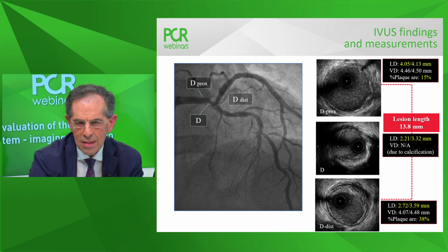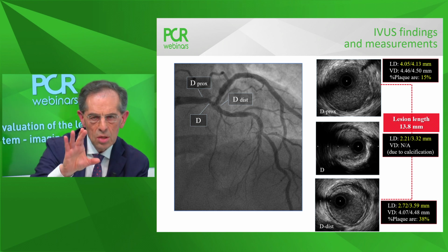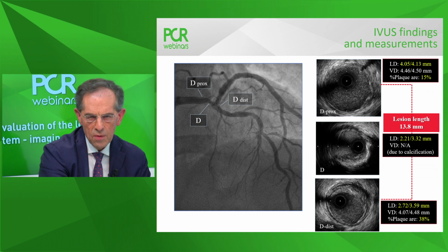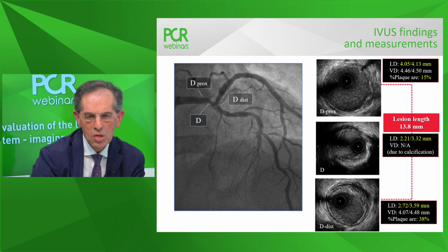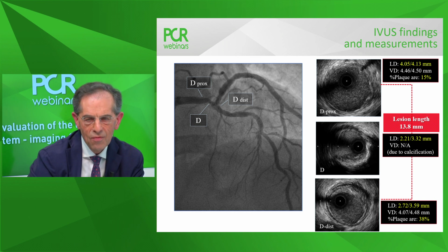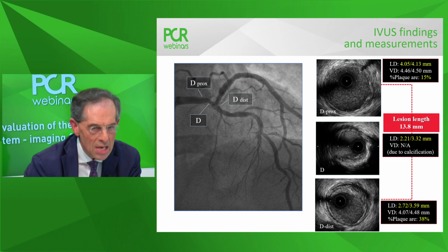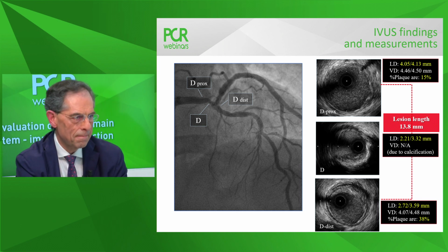Never land a stent in a very fragile lipid-rich plaque or echolucent plaque, and never land one when you have a plaque burden more than 50. So in addition, we decided for sizing, we decided for landing, and you may see also information about the lesion lengths. So you can take advantage of these measurements for guiding during the procedure.